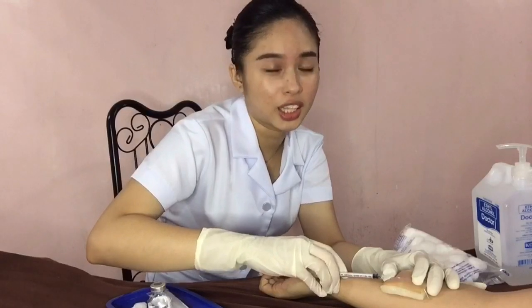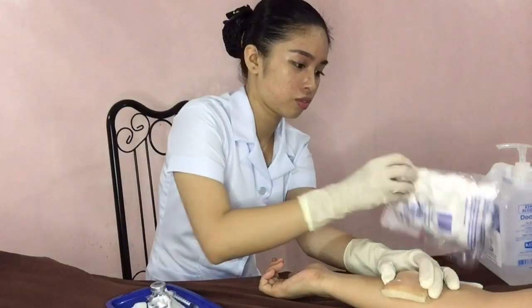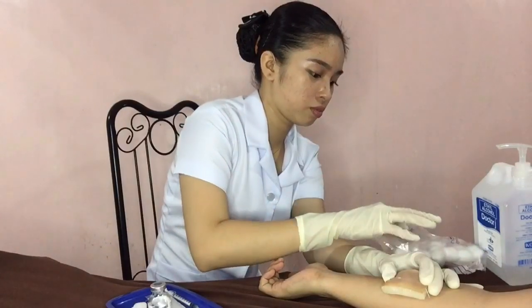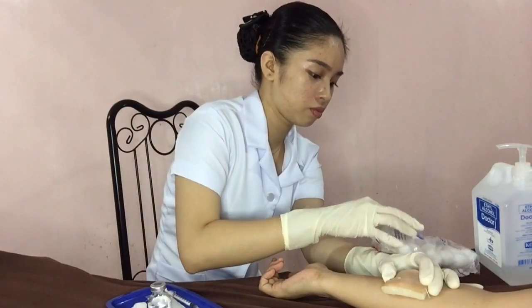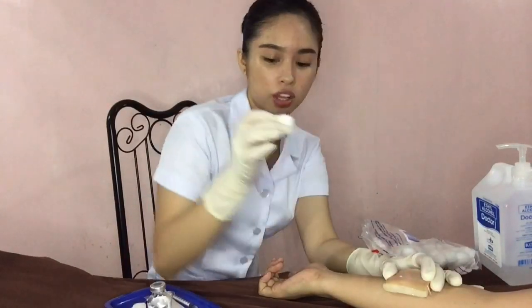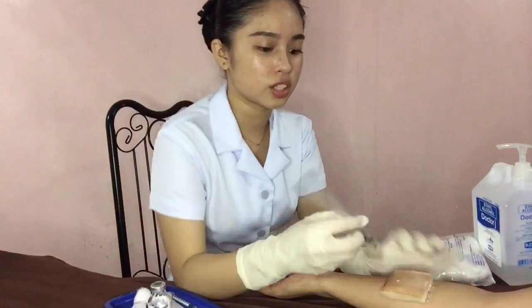Then withdraw the needle at the same angle and pat with a dry cotton ball. Don't forget not to massage the area. Then encircle the wheal with a blue or black pen. Then instruct the patient not to rub the wheal or erase the mark. So ma'am, do not erase this mark, okay?